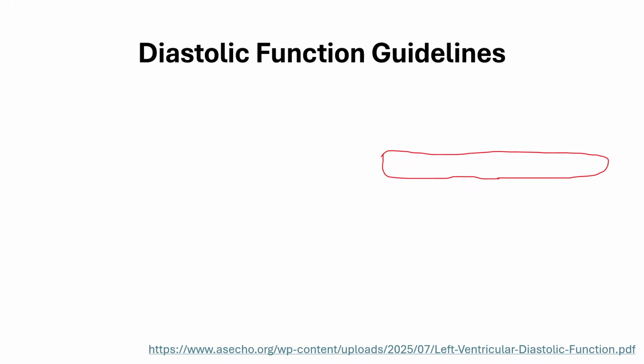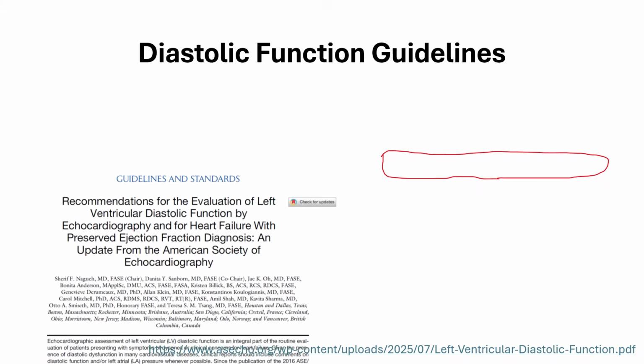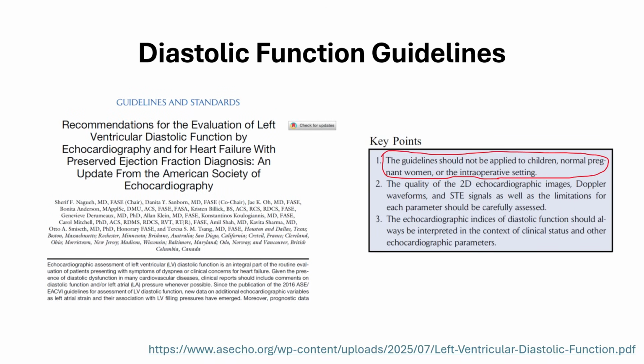Very recently, American Society of Echocardiography released its updated version of LV diastole guidelines. And here's a statement from these guidelines, saying that these guidelines should not be applied to children, normal pregnant women, or the intraoperative setting.